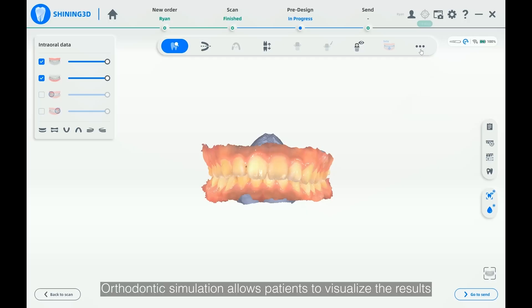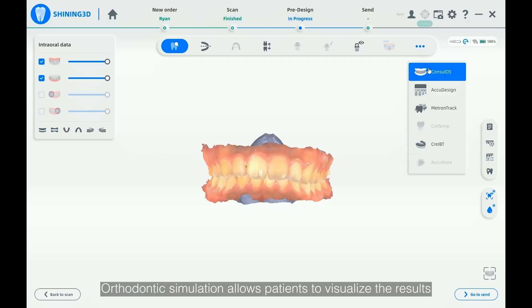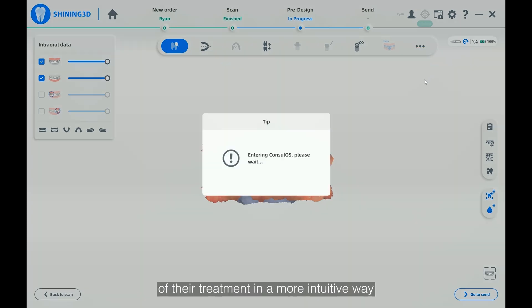Orthodontic simulation allows patients to visualize the results of their treatment in a more intuitive way, and helps doctors communicate better with patients.